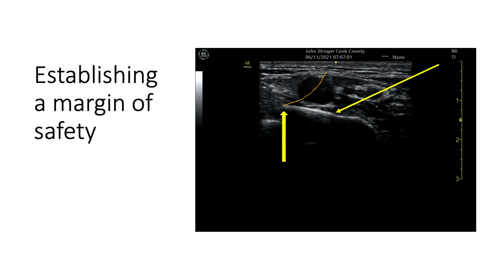So this is the same concept, that when the needle comes into action, it has to be in this image. So they are not disconnected, they're not different processes. These are steps in one single process. So you get this image, and then you bring the needle to this image, not to the other one that is behind or in front, but to this image.